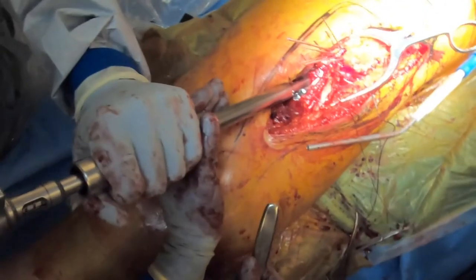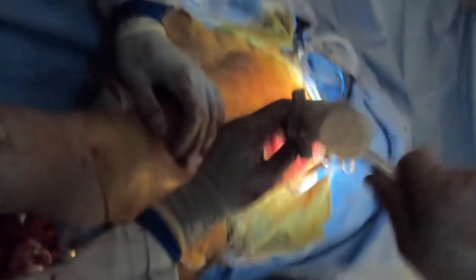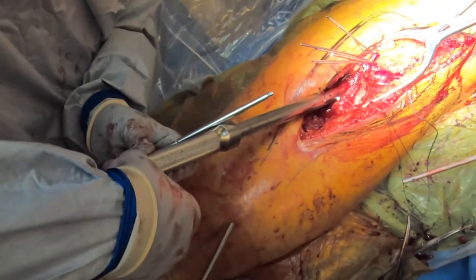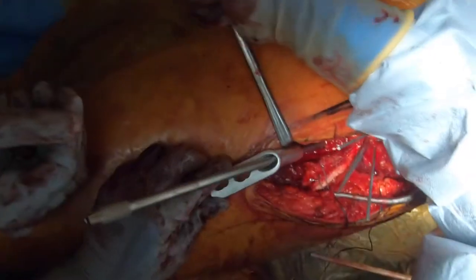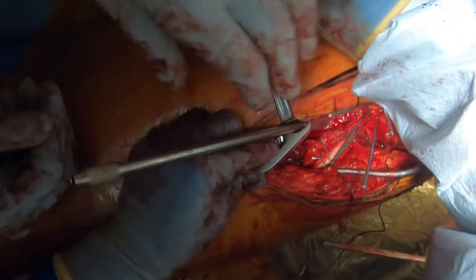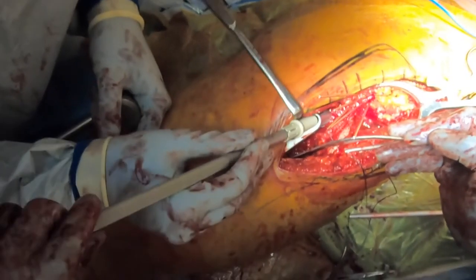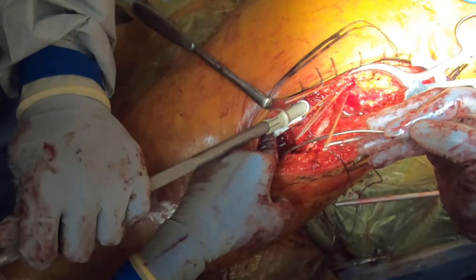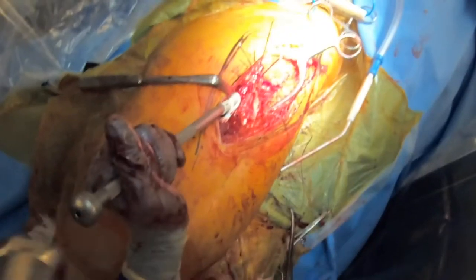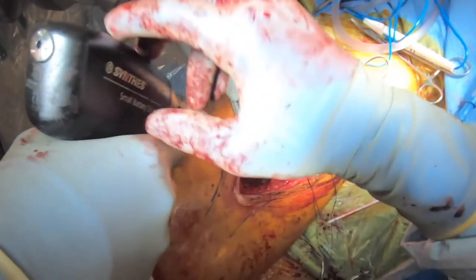The helical blade is then impacted down. The side plate is then attached and placed over the helical blade and impacted down. Two cortical screws are then placed along the side plate.